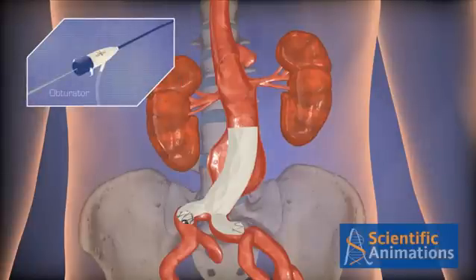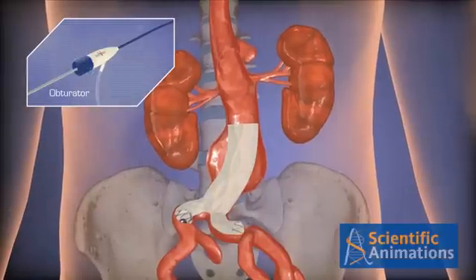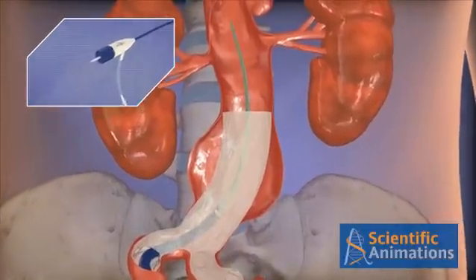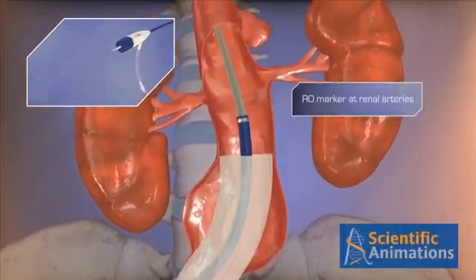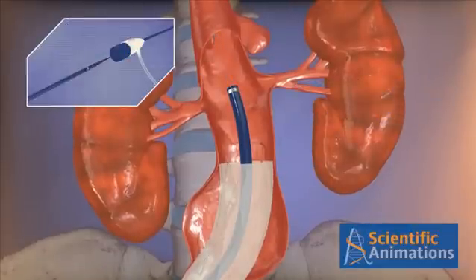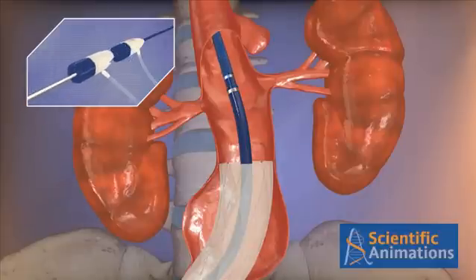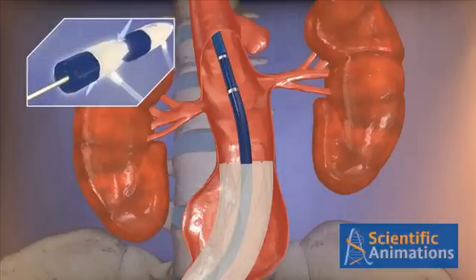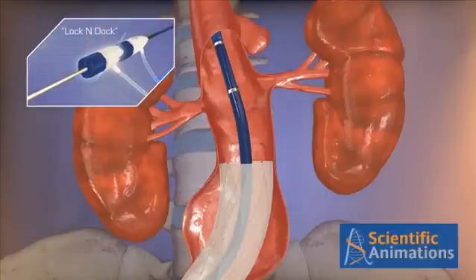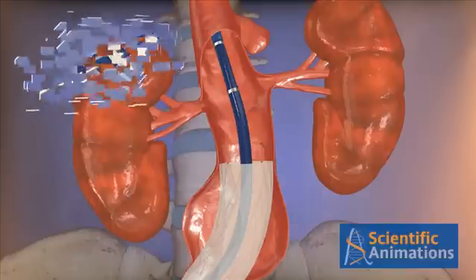When proximal extensions are required, insert the obturator into the introducer sheath by loosening the hemostasis valve. Advance the introducer sheath until the radiopaque marker is approximately at the renal arteries. Remove the obturator and advance the extension delivery system until you hear an audible click. This is the lock and dock mechanism, transforming the introducer and the accessory system into a single unit.